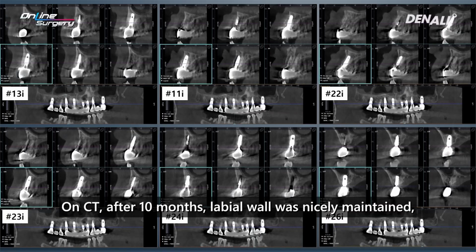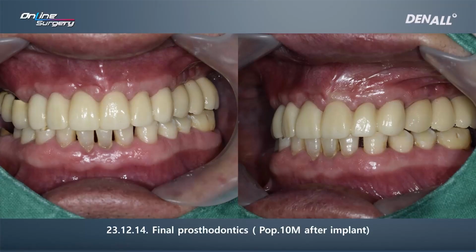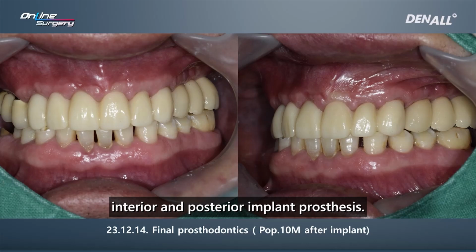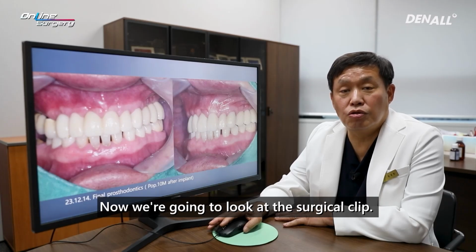On CT, after 10 months, the labial wall was nicely maintained, and the final prosthesis was delivered. This is the state with the final prosthesis: the anterior and posterior implant prosthesis. Now we're going to look at the surgical clip.